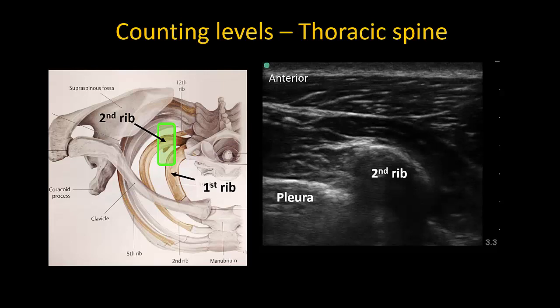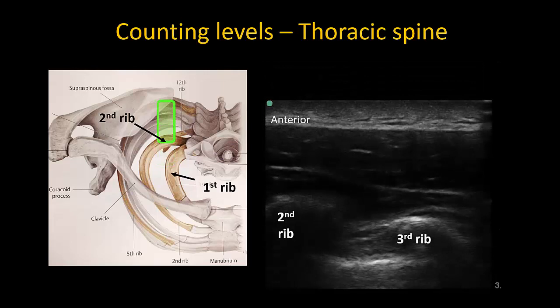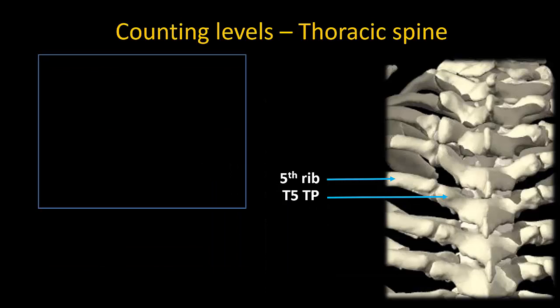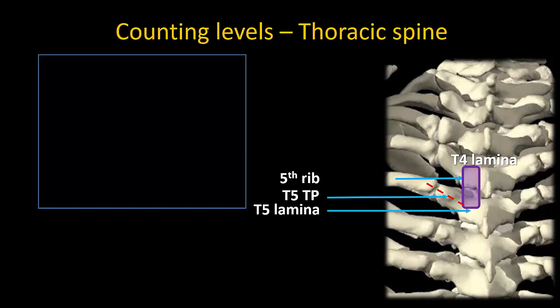From here on, it is just a question of counting from the second to the third to the fourth to the fifth rib and so on. When you have found the rib that corresponds to the interspace you are targeting, slide the probe medially to visualize the transverse process and then the lamina. It is important to note, however, that because of the cranial angle that the transverse process makes with the lamina, the lamina that is in line with the rib and tip of the transverse process is actually the upper one — the T4 lamina in this case — and the T5 lamina will be lower or more caudal. So in this case, following the fifth rib will lead you to the T4-T5 space. The T5-T6 space is the next lower one and not necessarily in view on the ultrasound image.